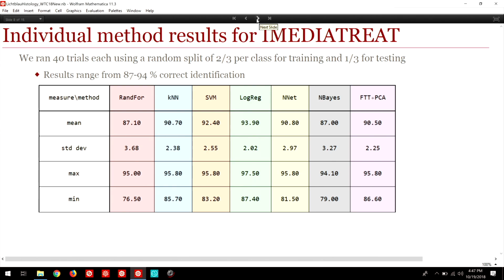And we do principal components, like we subtract the mean. I think we take a singular value decomposition, and we drastically cut the dimension there. And we then feed the resulting vectors into the Nearest function in Mathematica. So it's another KNN type of approach. However, it behaves very differently in terms of results for our purposes than the KNN method for Classify, so it turns out to be useful in its own right.